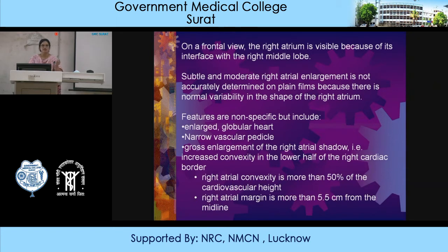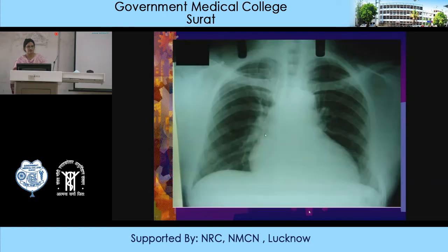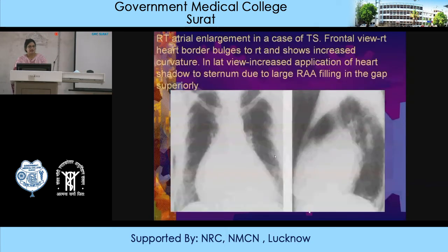You can see the right atrium is enlarged, projecting much beyond the para-midline. In a case of TS, right atrial enlargement is seen — the right heart border bulges to the right and shows increased curvature. On the lateral view, there is increased apposition of the heart shadow to the sternum because of the large right atrial appendage filling in the superior gap.